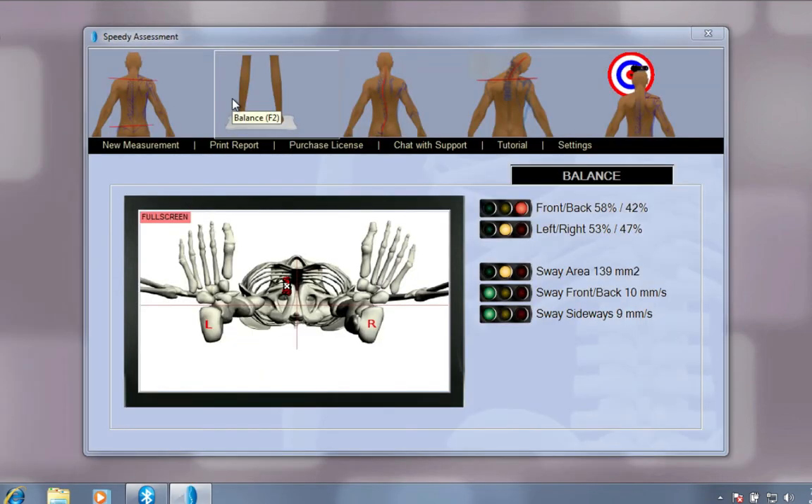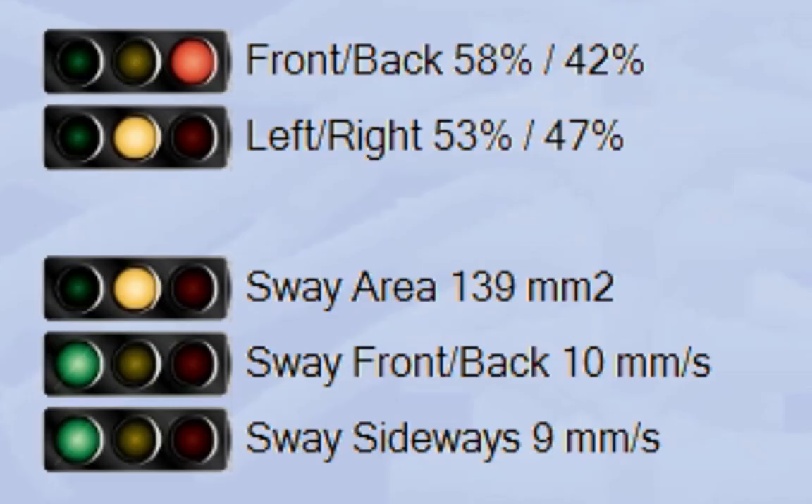The test is completed. Here you see the results. The traffic lights indicate green, good, yellow or red — indicating need for further examination. Good balance is closely connected to optimal posture. People with good balance will not deviate to one side or the other, nor will they stand with their weight over their toes or heels.